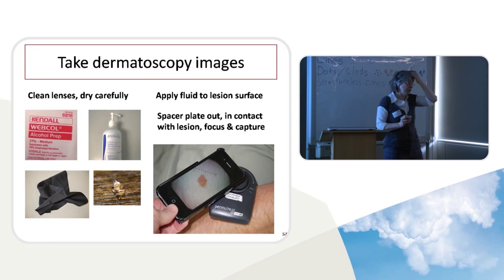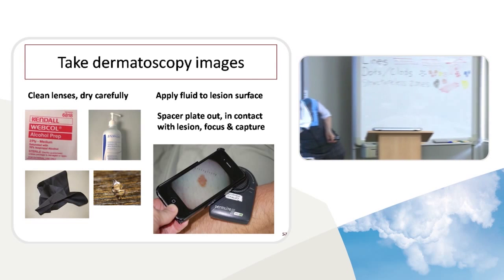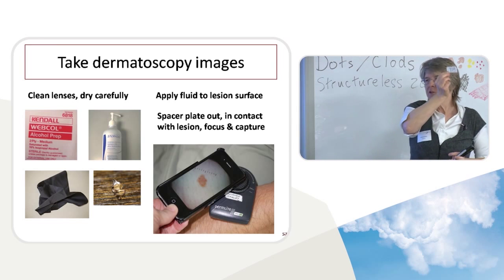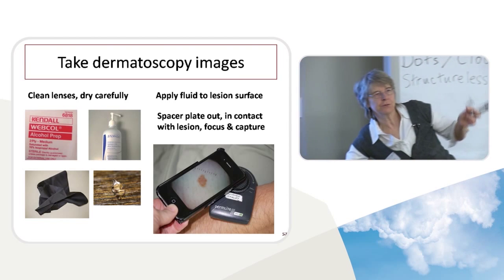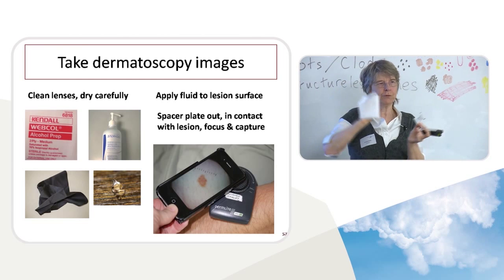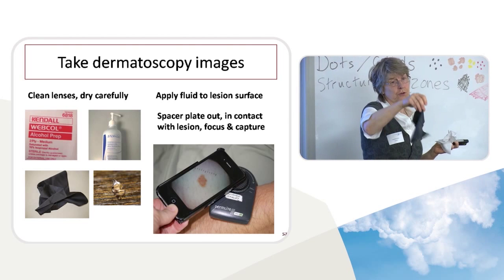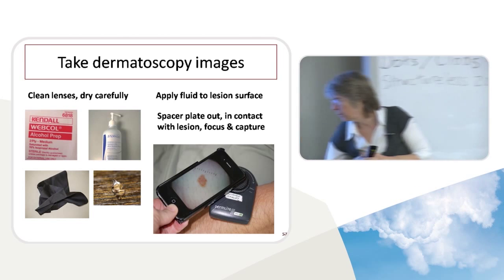So now we're going to take some photographs and we're going to get our dermatoscope out, and we do need to clean the lens. So I actually usually use Sterigel rather than one of these, but this is in my pocket if I don't have the Sterigel, but Sterigel's everywhere these days. So I clean the lens using this, but then it smudges. So it's really important after you've used your fluid to then buff. But these things are on our desks everywhere, so not too difficult. Using a proper cloth like this is much better because it's soft and better for the lens. But on the other hand, it soon gets dirty, and really you should be sterilising it between every patient, so it's not very practical. So practical would be those things.